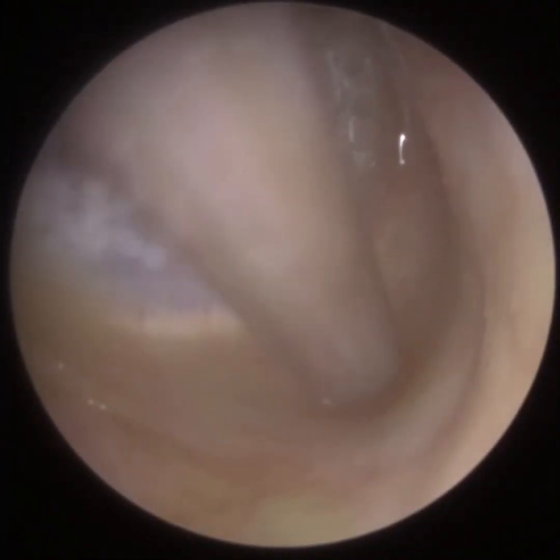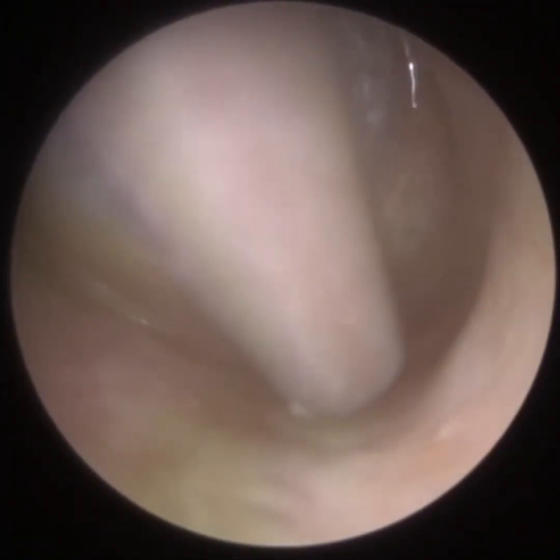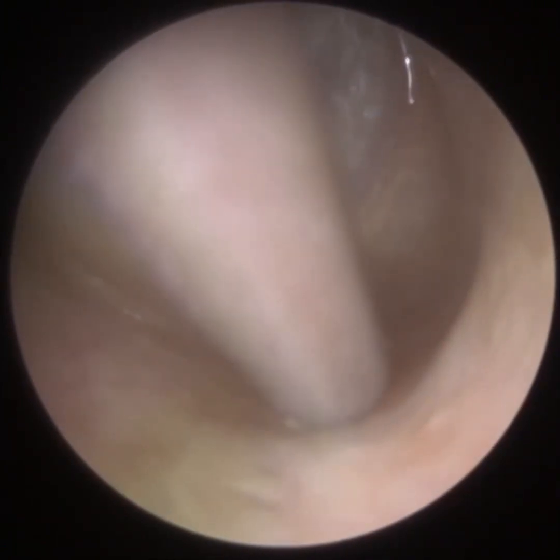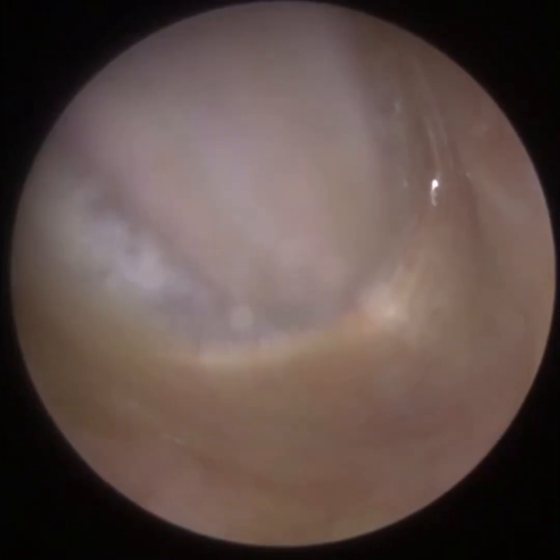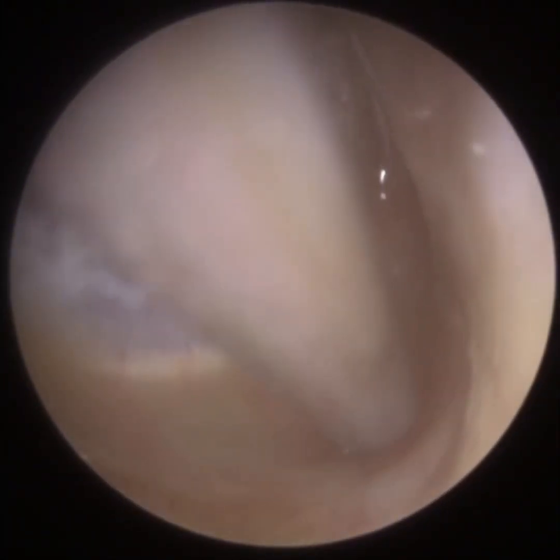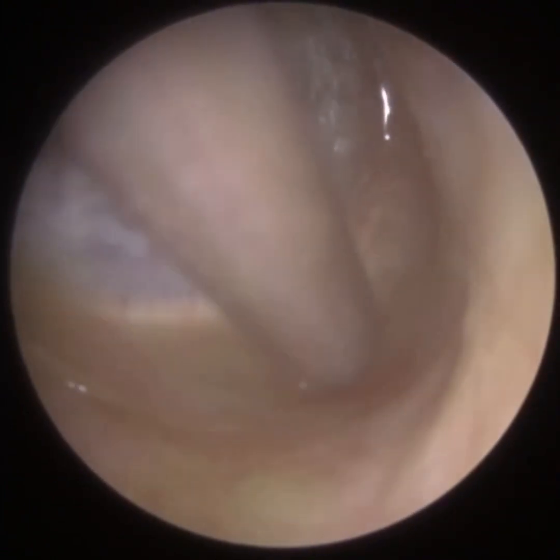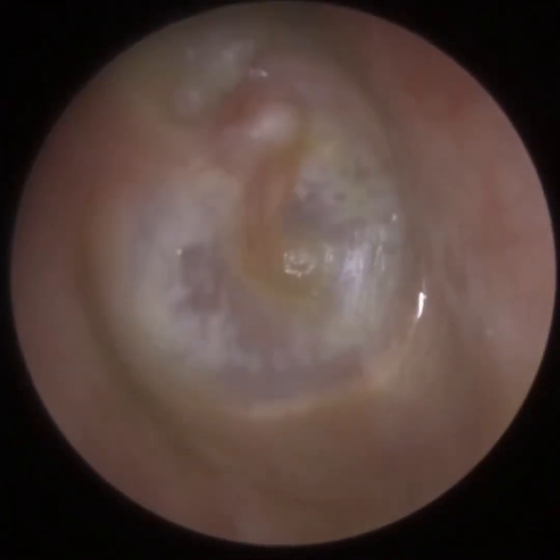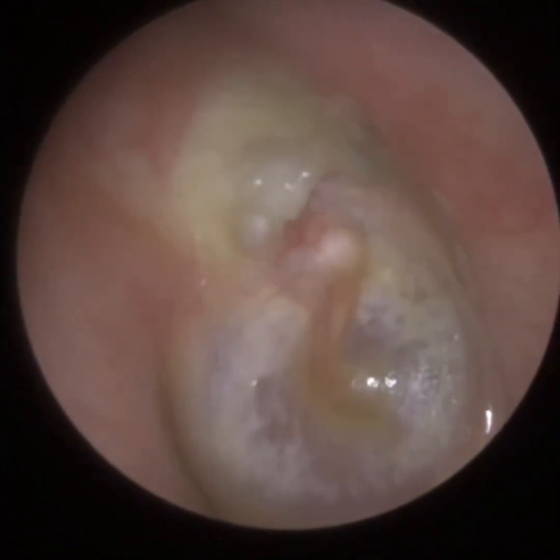It could just be that the patient was born with a very wide inferior recess — the annulus region, we call it. But my suspicion is that the infection the patient is experiencing, and all this discharge, is collecting in this basin, this trench, and it's causing erosion of the annulus — hence why it's a lot wider. We've more or less cleared all the discharge from the base of the ear canal now.